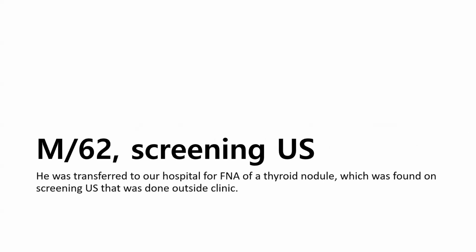This is a 62-year-old man. During the medical checkup, he screened his thyroid gland by ultrasound. He came here after being told to get tested at a large hospital because he has a nodule in his thyroid gland.